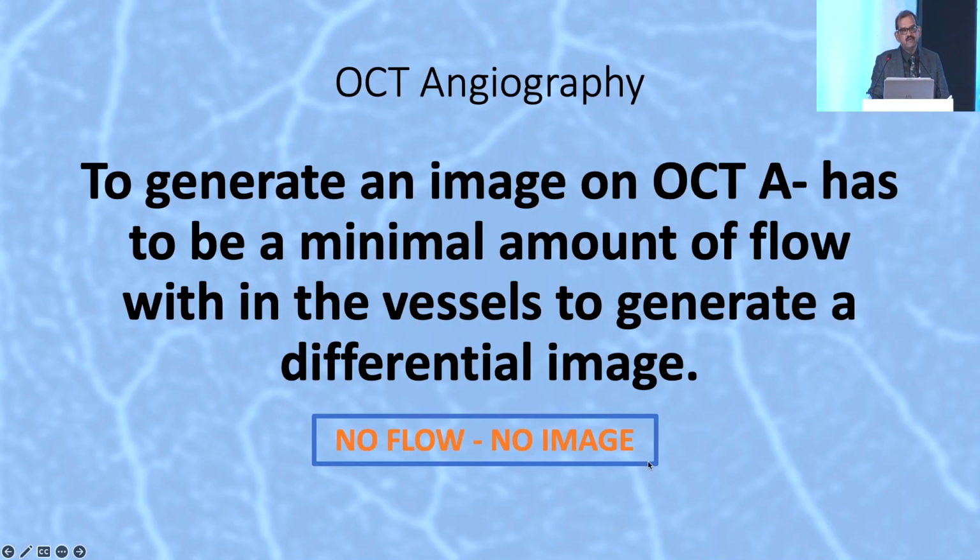To generate an image on OCT angiography, there has to be a minimal amount of flow within the vessels to generate a differential image. If there is no flow, there will not be any image.